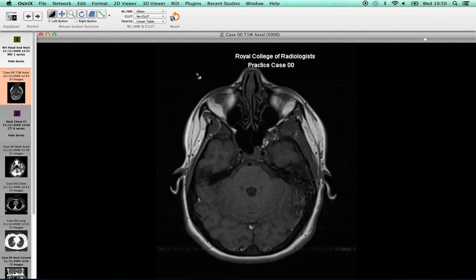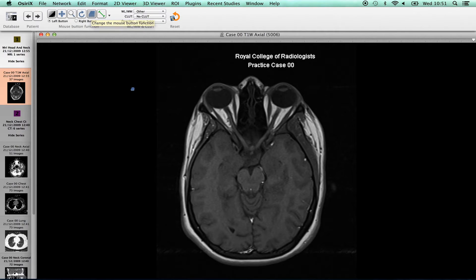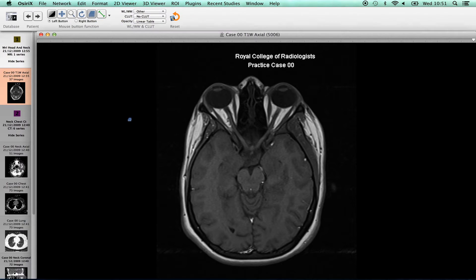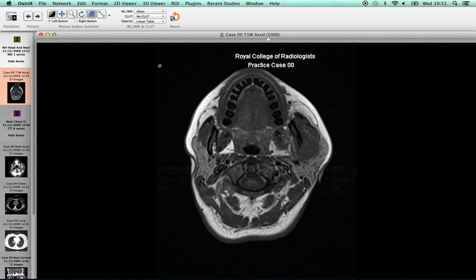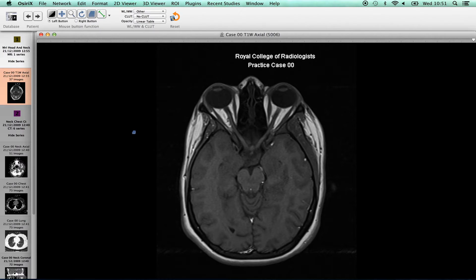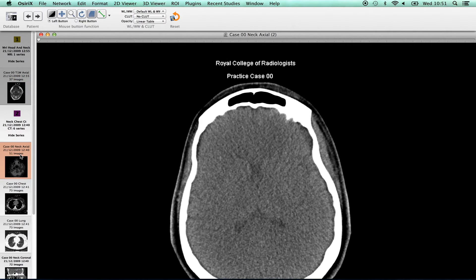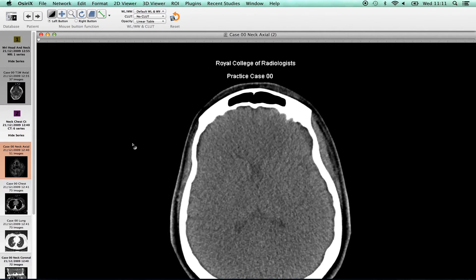The alternative is to click on the book button. The cursor will change to represent the book, and holding the left mouse button down permits candidates to scroll smoothly backwards and forwards through the images. To move on to the next series, click on the next thumbnail at the side of the screen. CT scans also form part of this practice case. Like the MRI functionality, after clicking on the CT scan, candidates can scroll through using the wheel on the mouse or the book button.